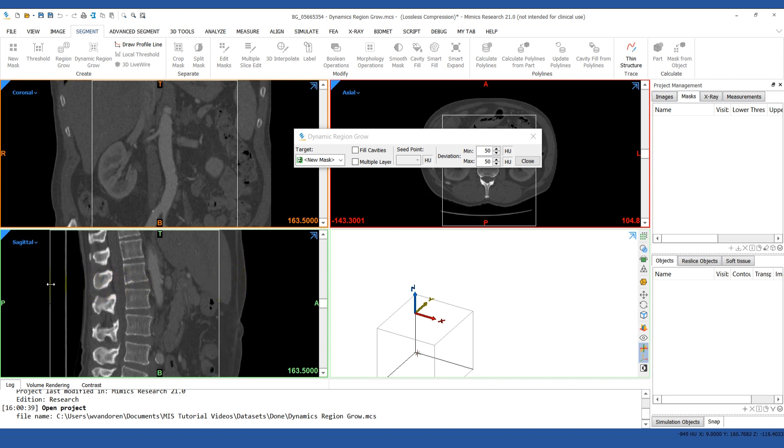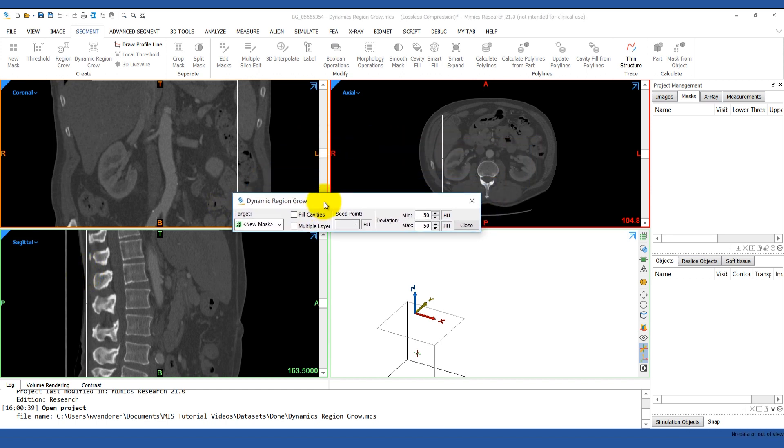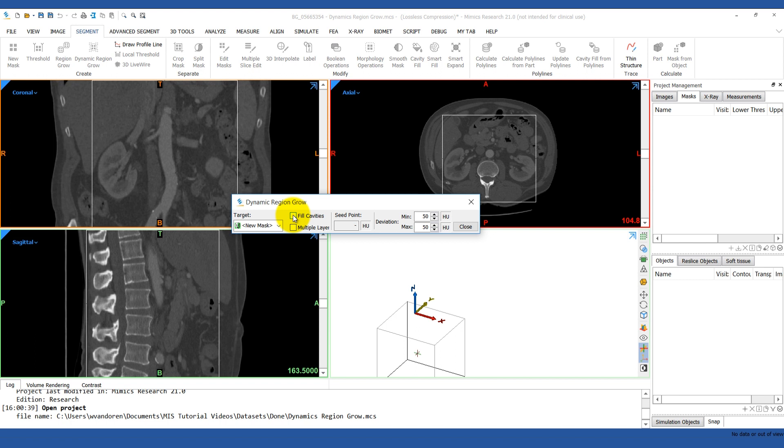In the dialog box, there are a couple of different options. If you want to try to fill in any holes within your mask segmentation, you can select the option fill cavities. You can also select the option multiple layer so that it includes all the layers in the data set.